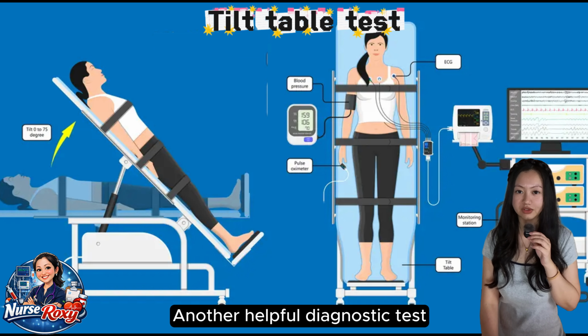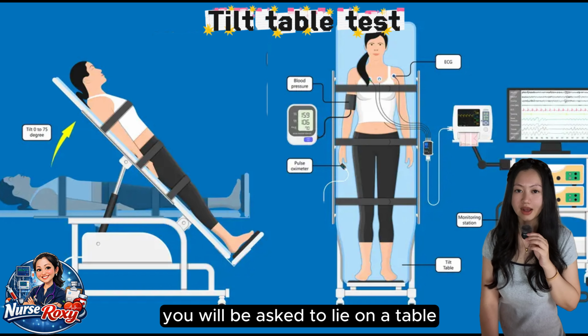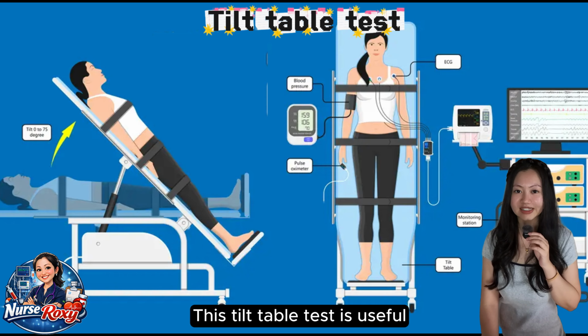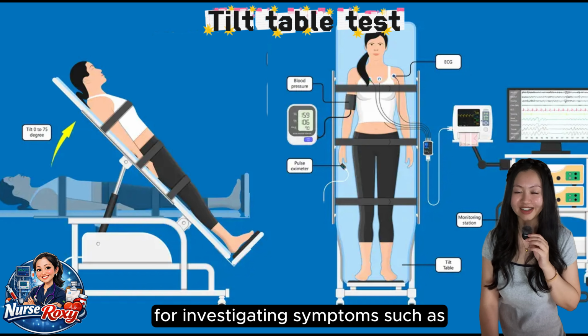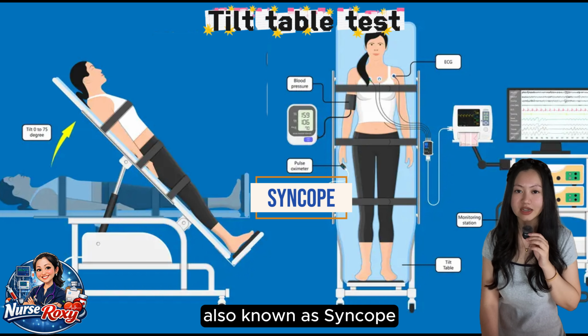Another helpful diagnostic test is tilt table test. In this test, you will be asked to lie on a table that gradually moves from a flat to an upright position, while your heart rate and blood pressure are monitored. This tilt table test is useful for investigating symptoms such as dizziness or fainting while you are standing, also known as syncope.